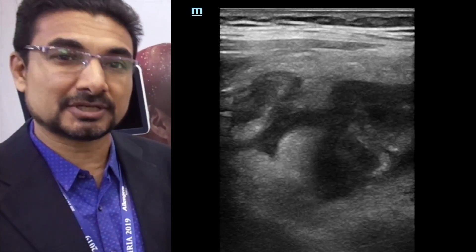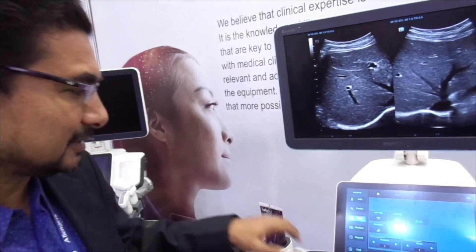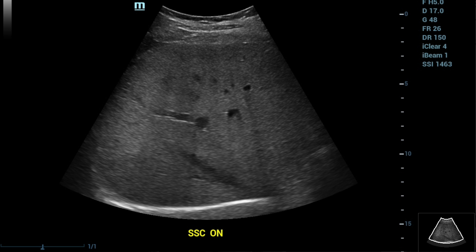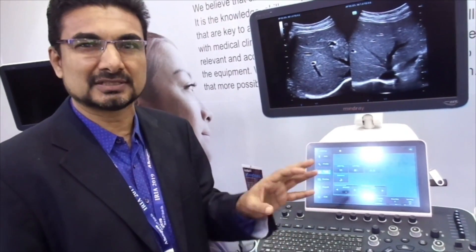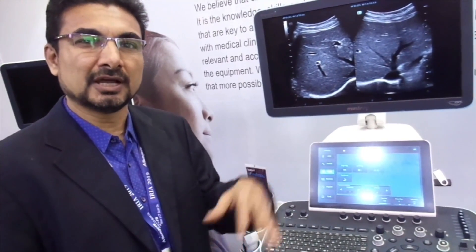That's very useful. For example, if the patient has a lot of fatty infiltration and you cannot see the diaphragm, there is a simple touch that decreases the frequency and increases the depth so you can see the entire liver quite easily. You don't have to adjust focus — just a click of a button gives you penetration, resolution, and a balance between the two.